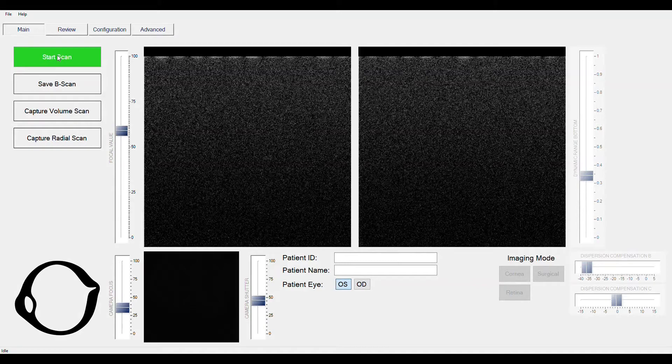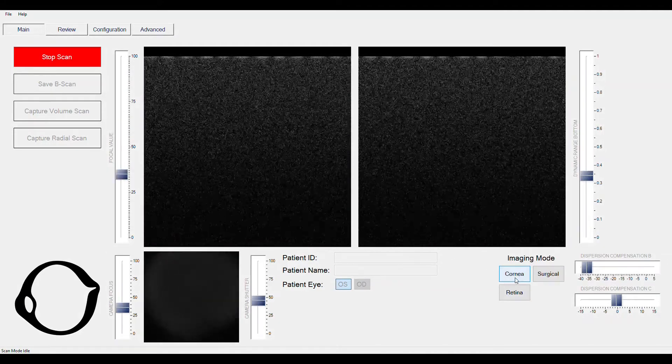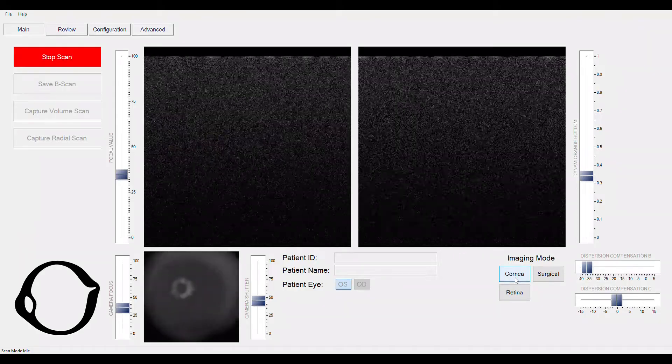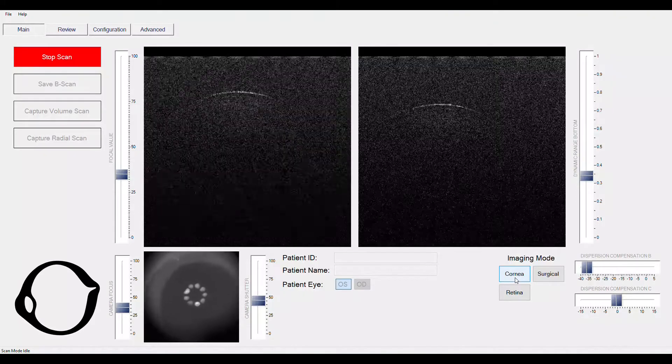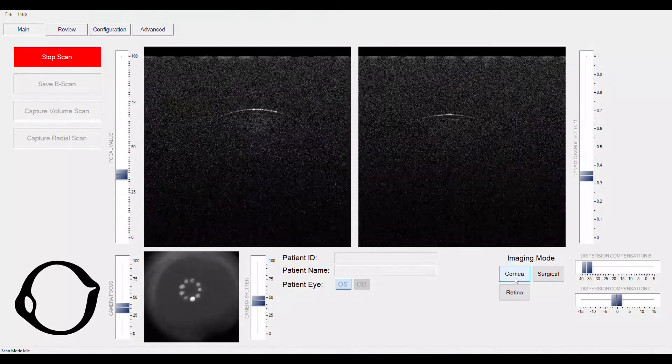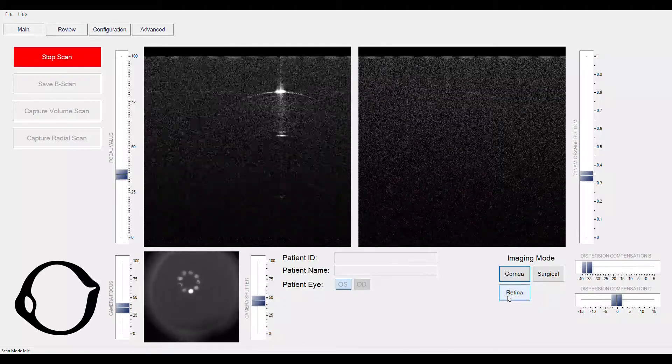Here is a close up of our OCT software. With one click of the green start button, we are up and scanning. On the lower right of the screen, we have pre-designated buttons to ensure ideal settings when switching between anterior and posterior imaging. On the lower left of the screen, the real-time fundus camera will aid in staying on target.